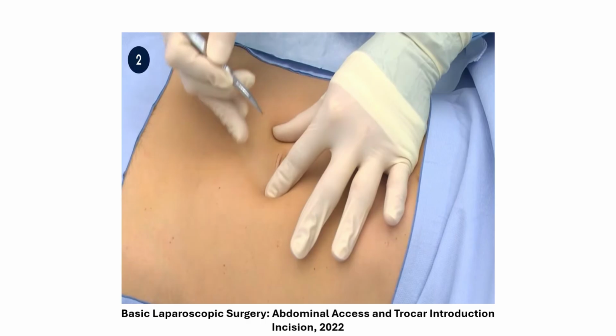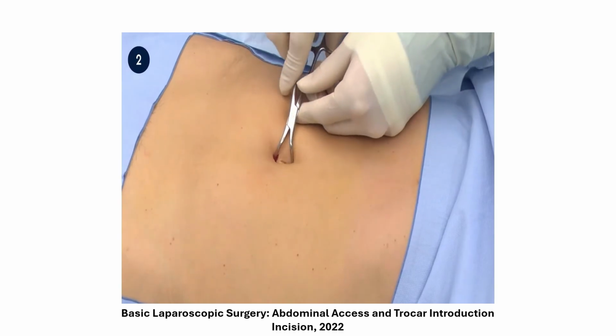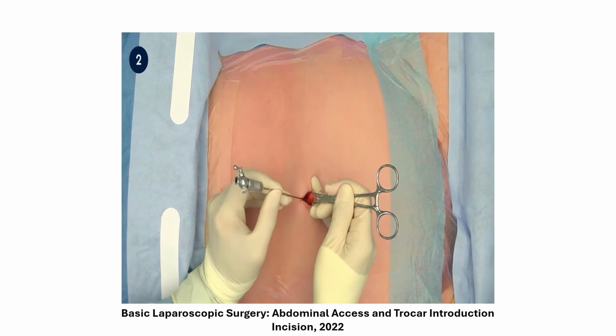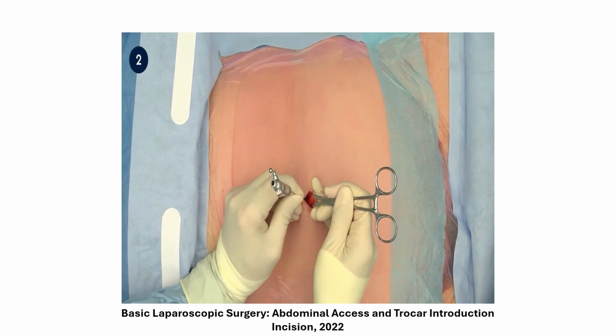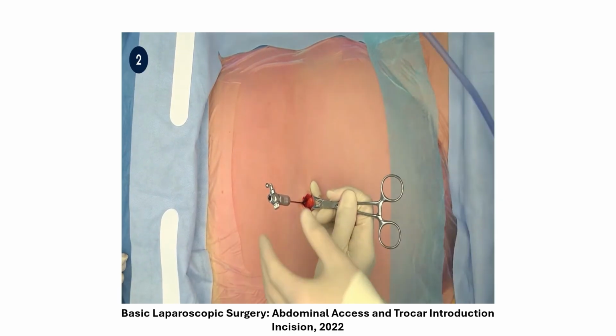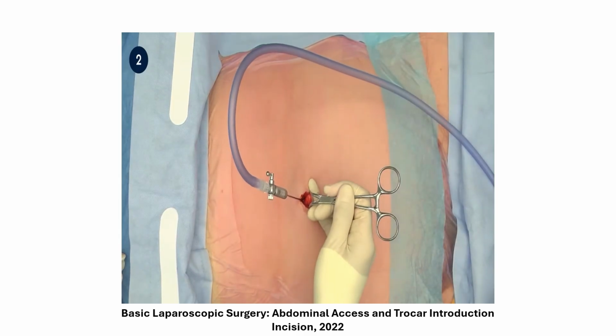For further review, right here they made a small infraumbilical incision, and then they're using that Veress needle. You can see that they went through the first set of layers, had that first click, and now they went through the second layers with that second click, and then they're going to use the test of insufflation to make sure they're in that intra-abdominal space.